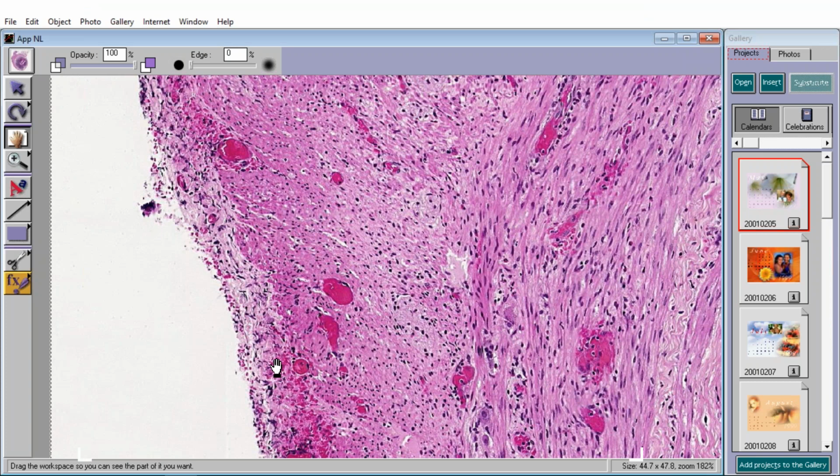Well, that could just be possibly due to surgical manipulation. How do you like that? So if I got to tell you a story, I'm not sure if you'll believe it, but there was always a joke among surgeons that if they removed an appendix and they were afraid that the pathologist was going to call it normal, they would rub the surface of the appendix very hard to try to make it look inflamed. Well, it's certainly hyperemic, but in order to make the correct diagnosis of acute appendicitis, the muscularis has to be inflamed, because the outer surface could just be inflamed from some local peritoneal process also.